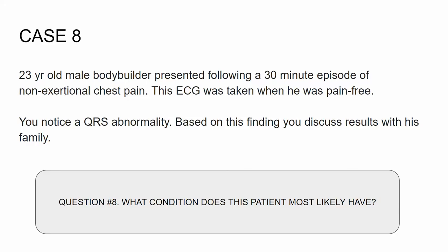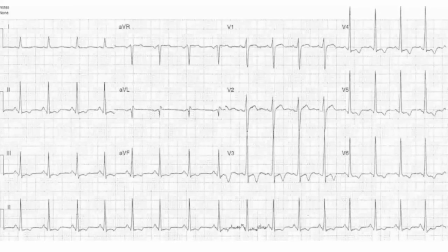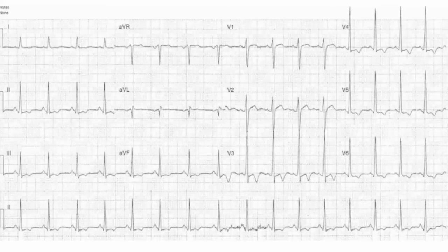Number eight — let's look at the EKG. What do you think? Well, this is a little on the tricky side. You notice that these QRSs are pretty tall. Let's go over some rapid rules to know if we're dealing with LVH — left ventricular hypertrophy.